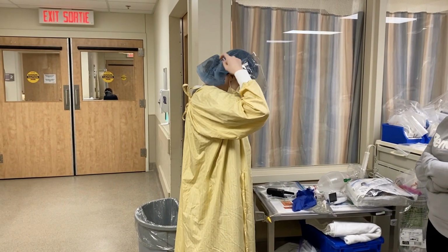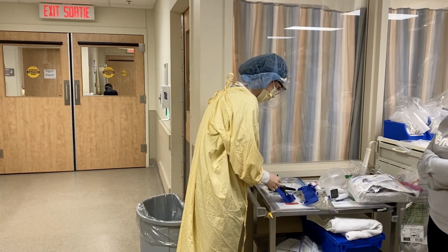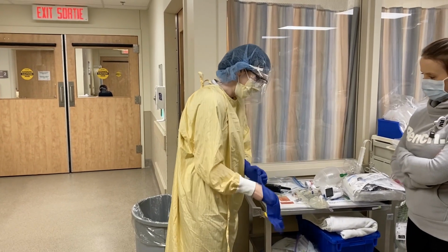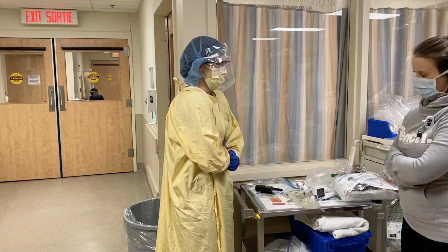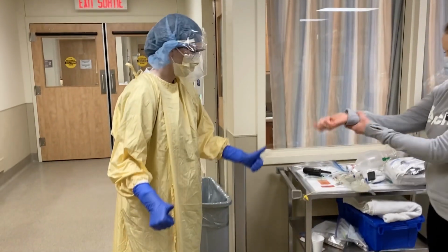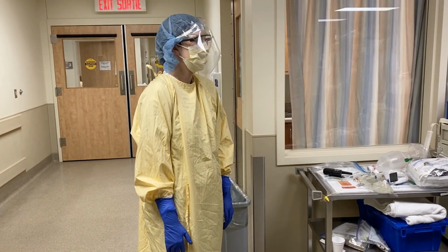So you have our goggles, face shield. And last, Lacey's going to put on her gloves. Typically for aerosol generating medical procedures, it varies. We're recommending double gloves. In this situation, we're going to use one pair. Yep, you're good. Your cuffs are up, nothing showing. The only thing is the neck, but we'll be mindful of that.